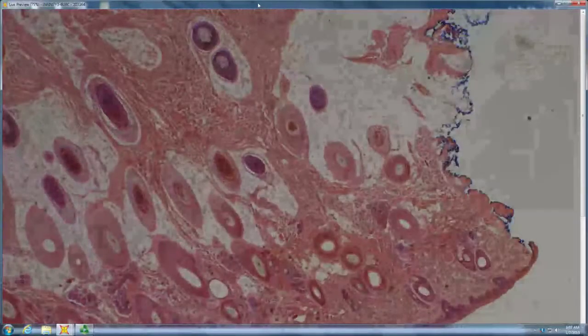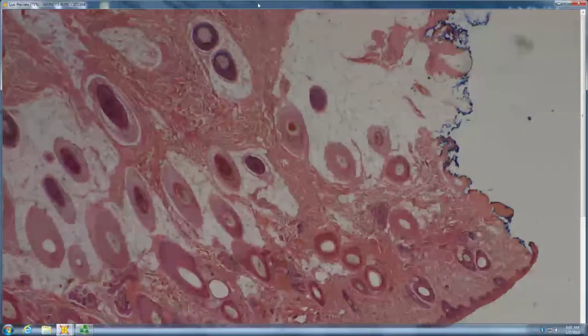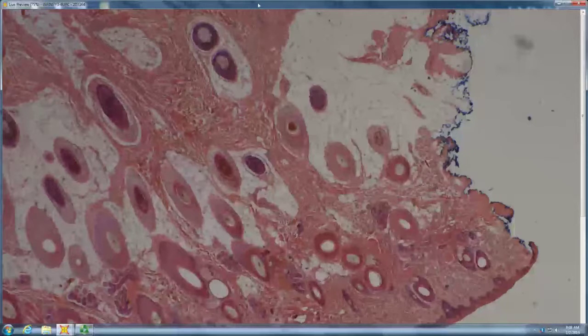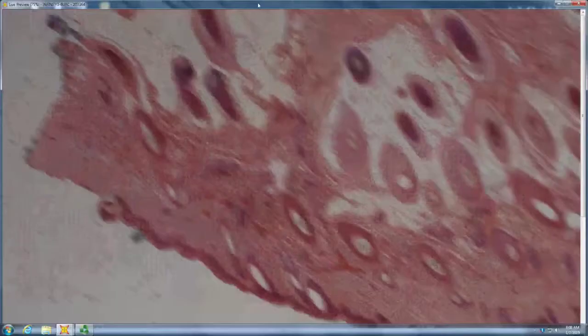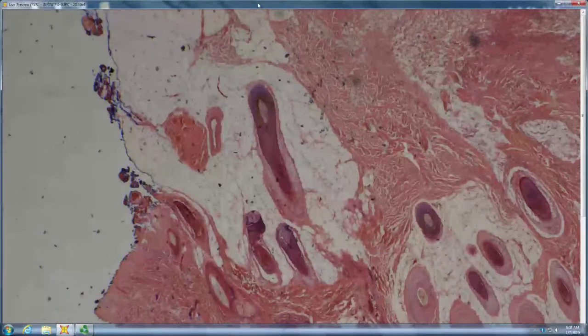Neuroblastomas can metastasize to skin. This year we had a little kid with a heel nodule that was metastatic neuroblastoma. So we definitely see it. It's a kid, it's a small blue tumor, you've got squashed carrot cells, it's probably going to be neuroblastoma. And unfortunately, when we see it in skin, it's already metastatic.